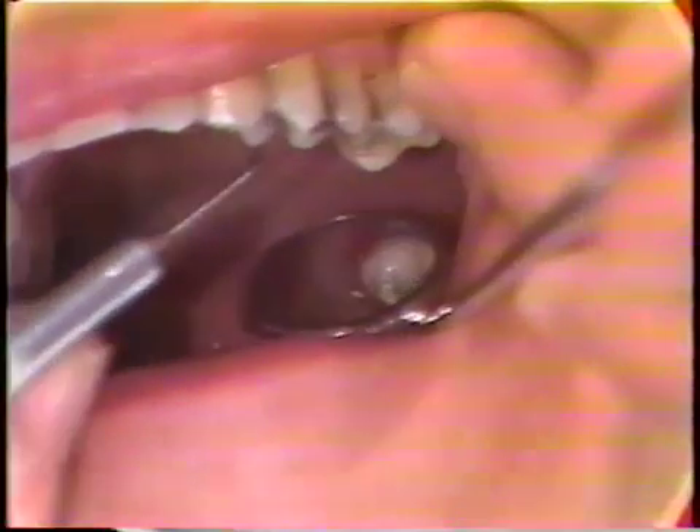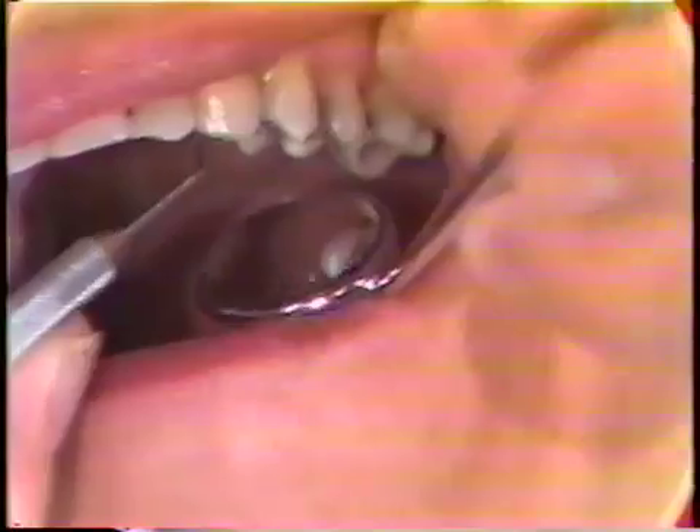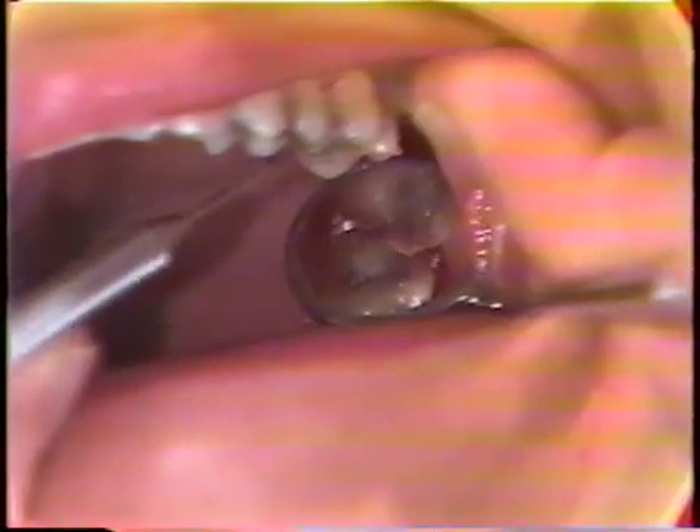The next step is to take the sickle explorer and check interproximally to see if there is any material left in between the teeth. Between the bicuspids, there's nothing. Between the bicuspid and molar, there's nothing. Between the molars, there is a little dressing material left, and the assistant will pick that up after it's been shoved out from between the teeth. On the distal side, there's no dressing either.